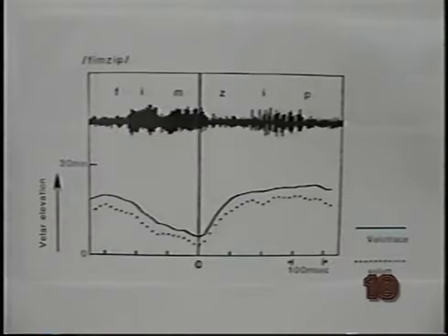In a second evaluation study, cineradiographic films and velotrace data were obtained simultaneously from a single subject. The velotrace was positioned in one of the subject's nasal cavities, and a thin gold chain was inserted through the other nasal cavity and positioned along the velum and down into the oropharynx. The frame-by-frame measurements made of the highest point of the velum and of the vertical position of the tip of the internal lever are seen in this figure.